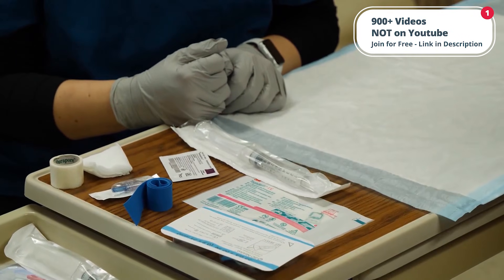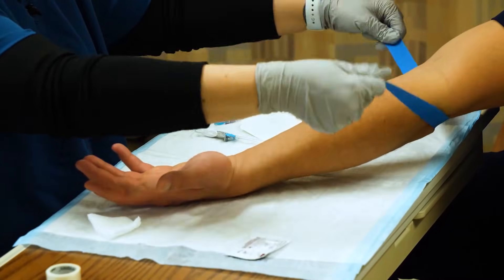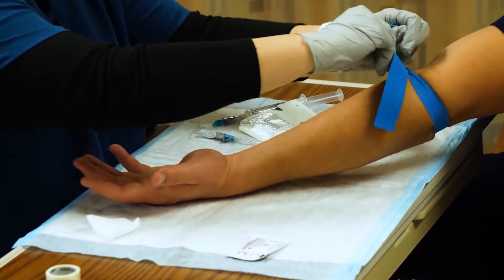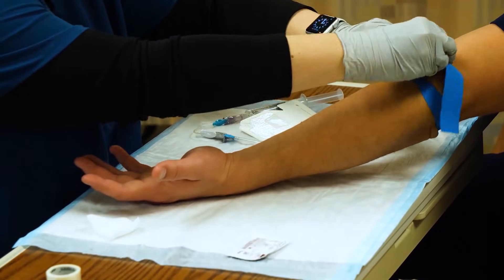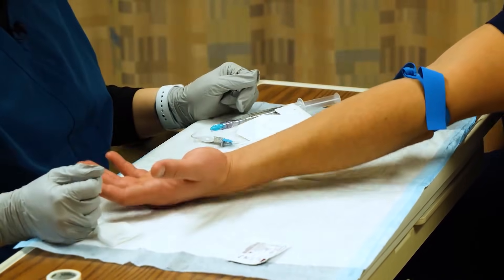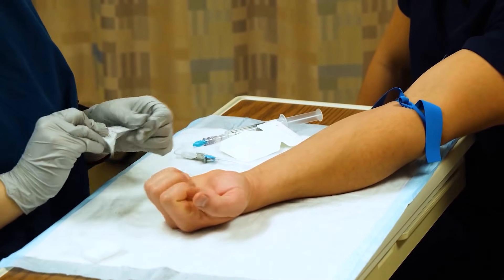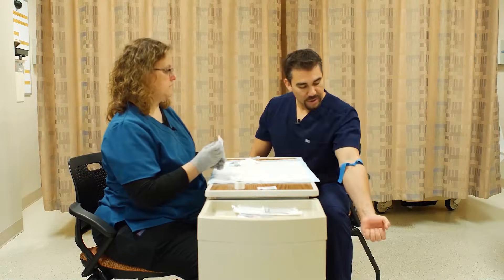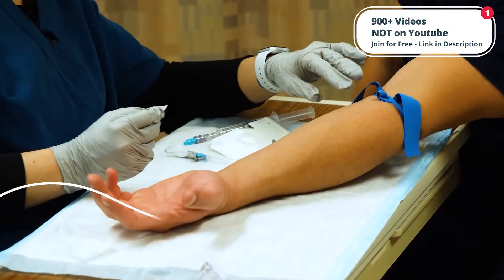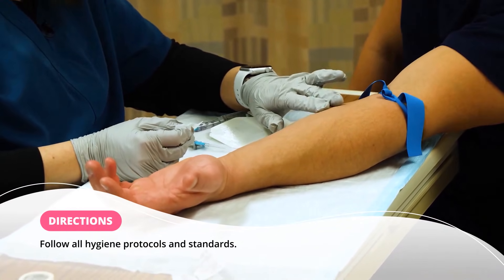We have to grab all these things before we go to the patient's bedside. For the tourniquet, pull in this direction, pull straight across and tight, pull this one extra tight, and tuck it in. Too loose will impede your ability to get a good vein pop-up. And you can help by going dependent and squeezing the hand. Then lean in and identify which veins are decent because they're squishier.